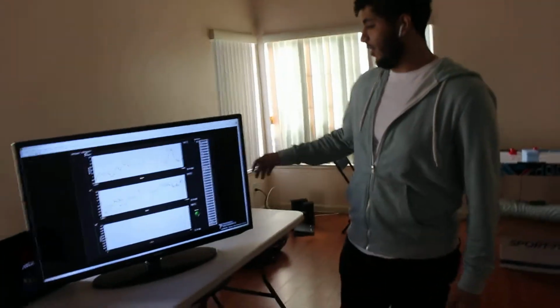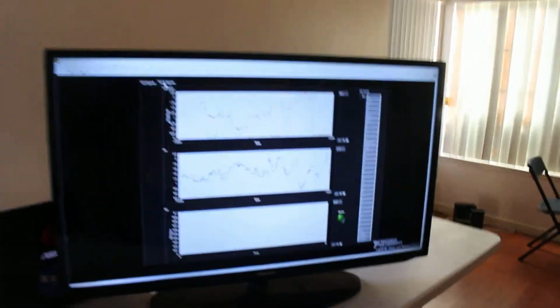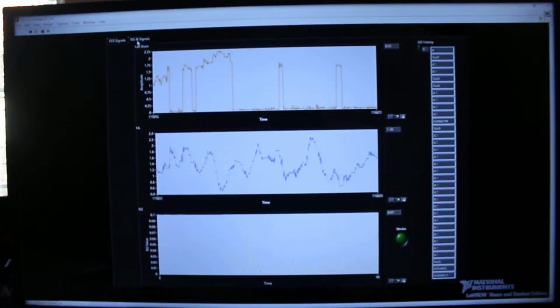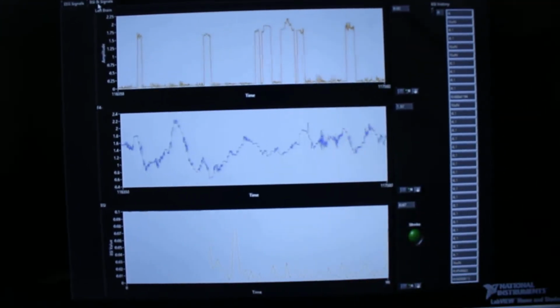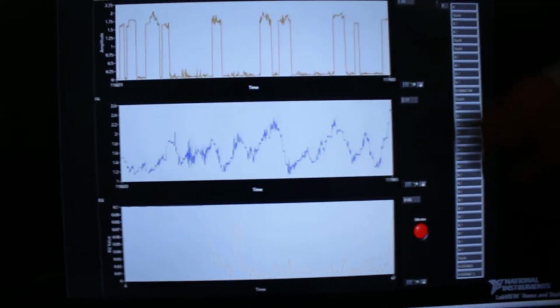So when George pushes the red button, this LED right here will turn red after approximately 10 seconds. And the BSI data from the current session is shown on the bottom right here. This represents the left signal, and this represents the right signal. And as you can see, the LED is now red.